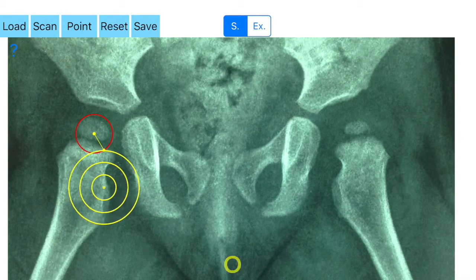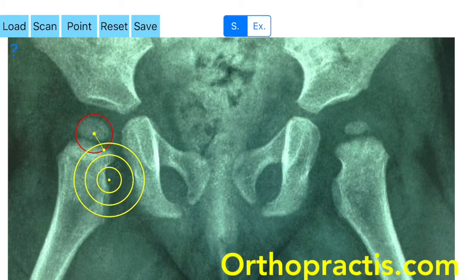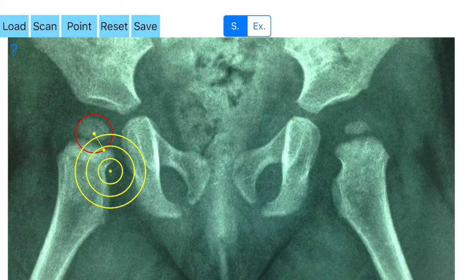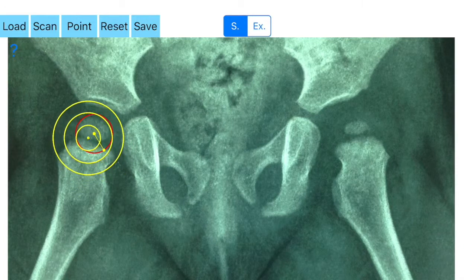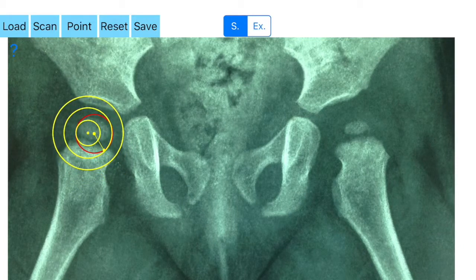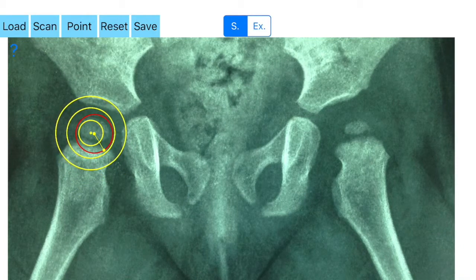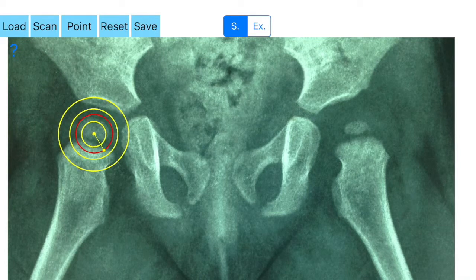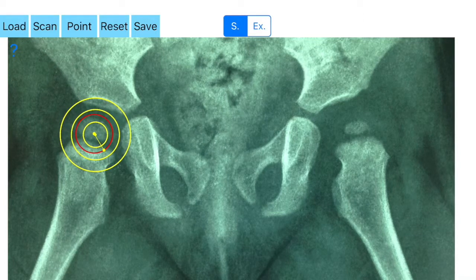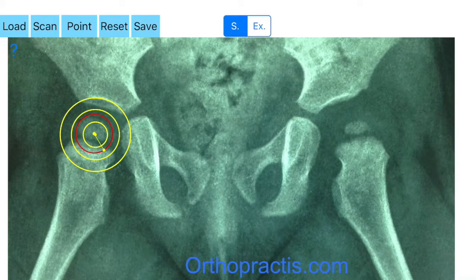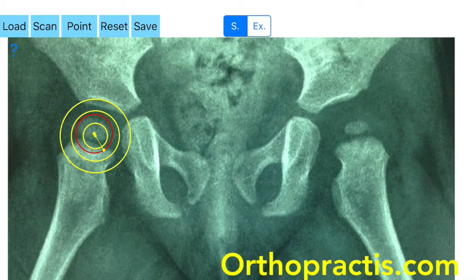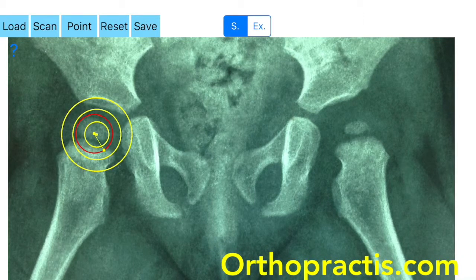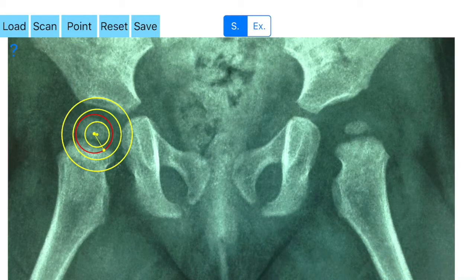If the button S is highlighted, you have chosen the simple method of measuring congruence. Using the transparent circular Moses template, you aim for the best-fitted circle of the acetabulum circumference in the same manner as before — this time aiming the best-fit circle towards the weight-bearing area of the acetabulum, namely the sclerotic roof. Usually you need to focus on the next larger circle of the transparent template, while keeping the center of the template inside the previous red circle of the femoral head.